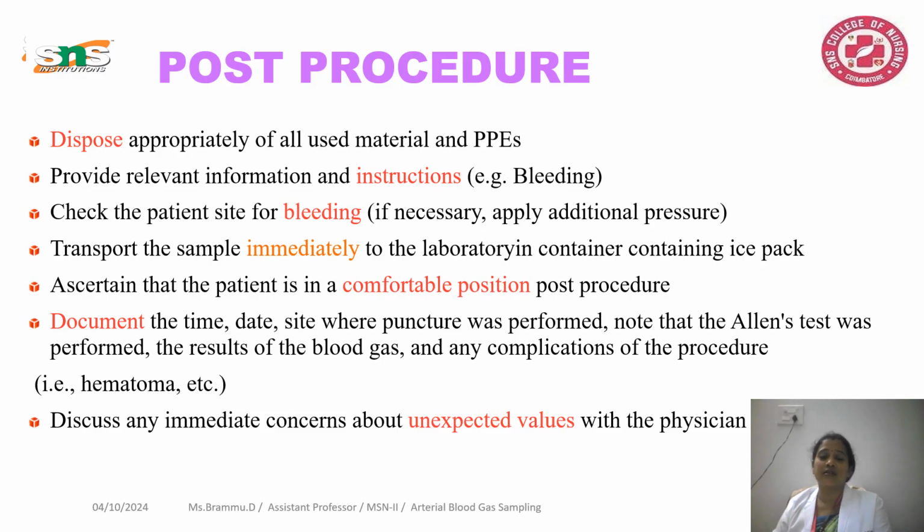If it is a puncture site, arterial, brachial or ulnar, then bleeding or hematoma must be assessed, and we should always immediately transfer the sample to the laboratory with an ice pack, so that you have the exact findings of the patient.